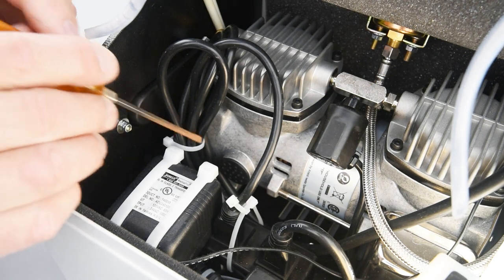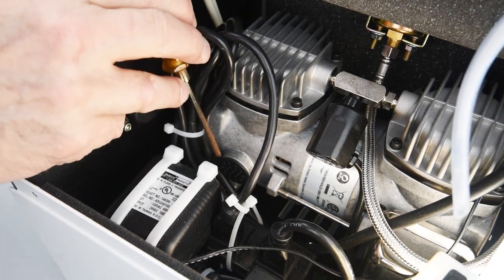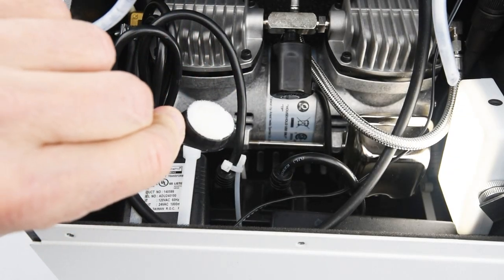Place a flathead screwdriver behind the extended tab of the intake filter cap and pry loose from the compressor body. Once the intake filter cap is loose, grasp the tab and remove from the compressor compartment.